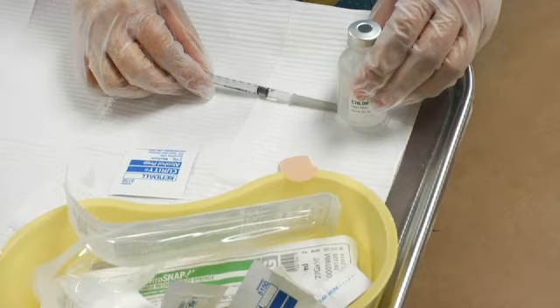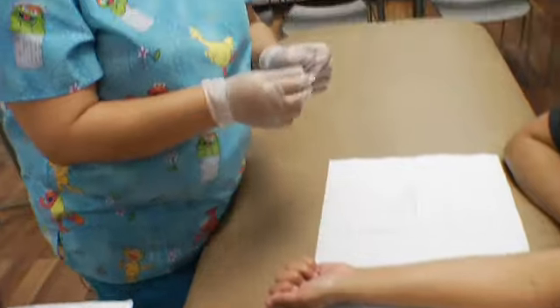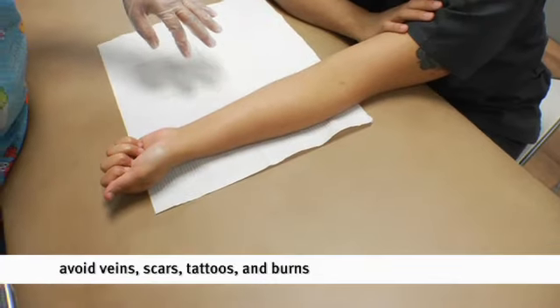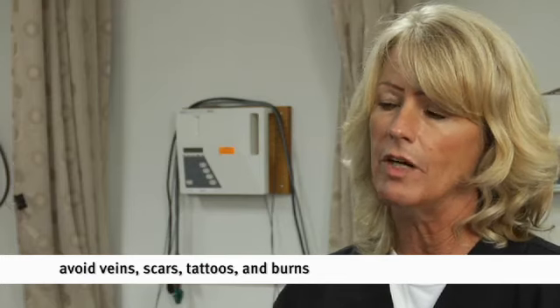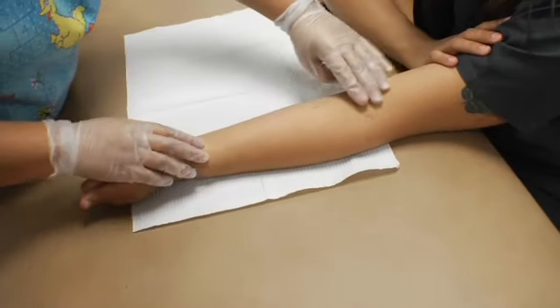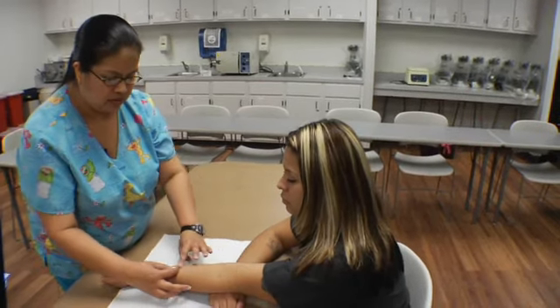We're going to use standard precautions in everything we do — we'll wash our hands first, then pick a site. We typically teach on the upper forearm. We want to stay away from visible superficial veins, tattoos that are a year or less old, burns, and scars. A trick would be measuring from the wrist to the inner elbow — this would be your safe zone, or you can come towards the middle.